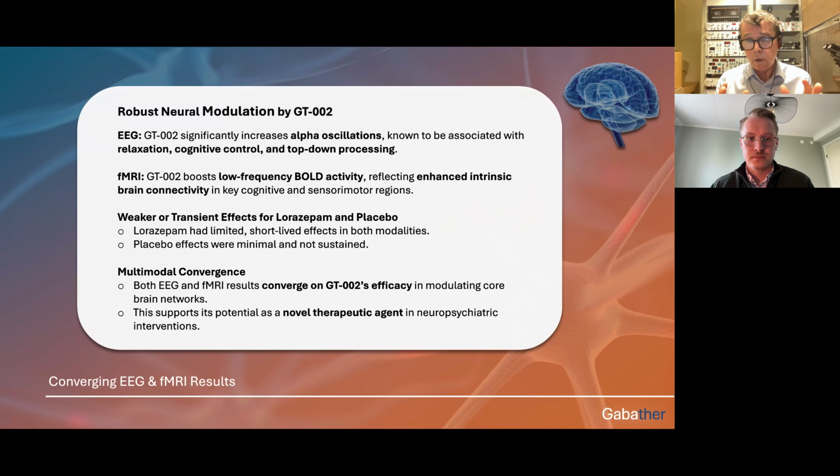So you remember that in fMRI, what you're measuring is actually an activation of the brain blood flow in that particular brain area. You're measuring a signal that comes from the blood. And we infer then, okay, the more BOLD signal you have, the more active that area in the brain is. In the EEG, you're measuring the electrical signal directly, a little bit different. Long story short, these two are congruent. We have slow alpha oscillations, low frequency, that we measured with the EEG, and we have fMRI low frequency oscillations too.